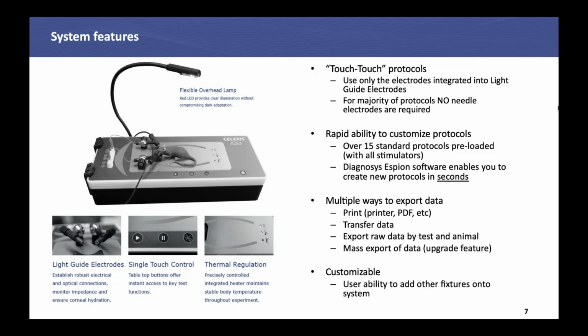We don't use the same stimulators for rabbits. We have ones that look a little bit more like photographer's lighting lamps. We recommend using electrodes with those. We do have rabbit configurations, and they work quite well.